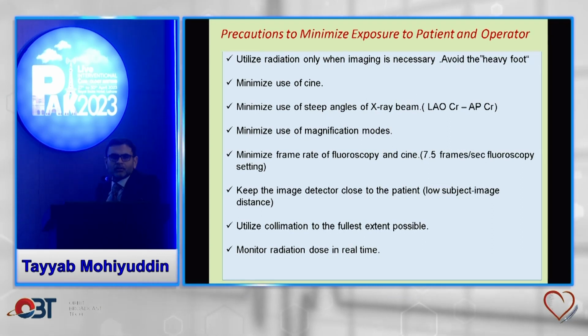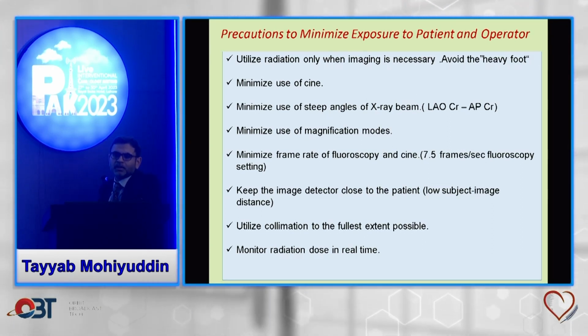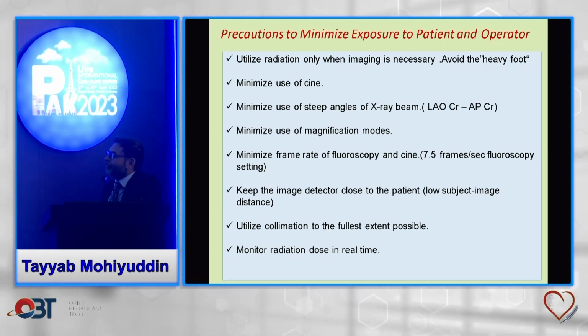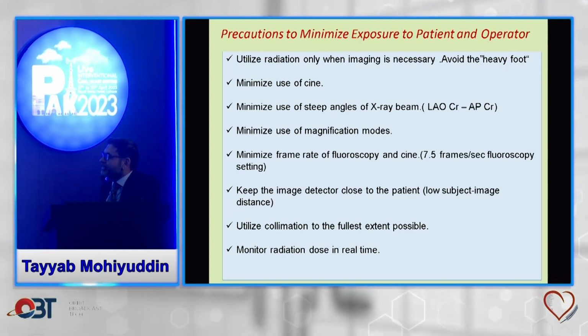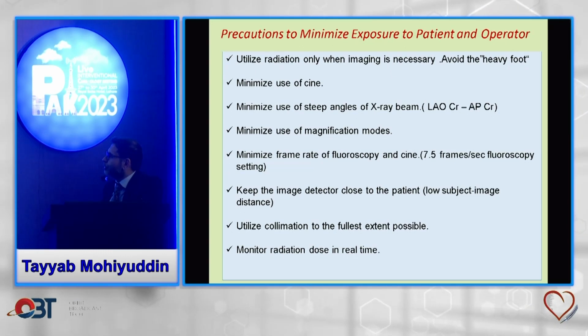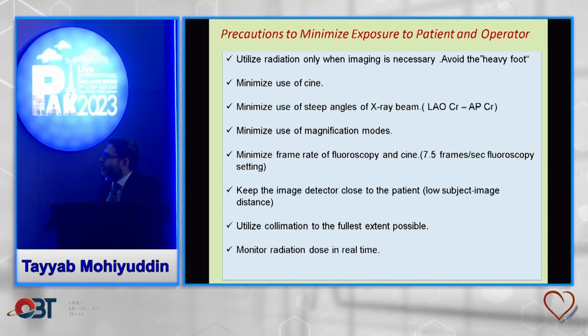This is the last slide. Now, let's say you were to sleep through all of my talk, if you just give attention to this last 1 minute, this is the summary of it. So avoid heavy foot. Where you don't need cine angiogram, just do last image hold. It'll make a big difference to your radiation dose. Minimize AP and LAO cranial. Do it if absolutely you have to.